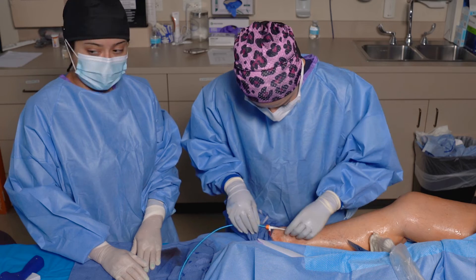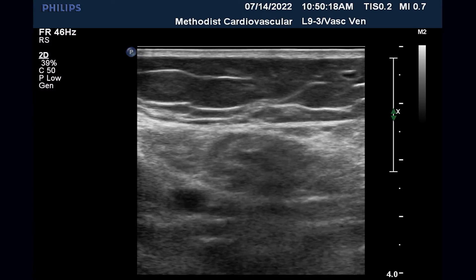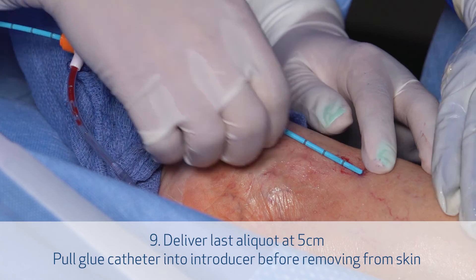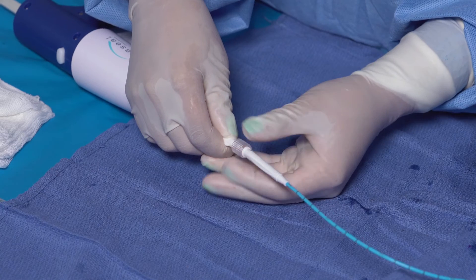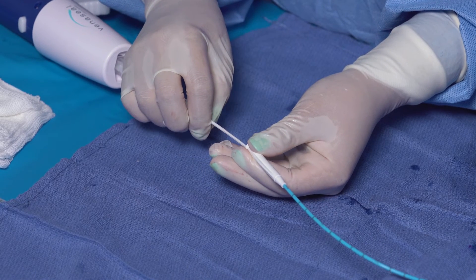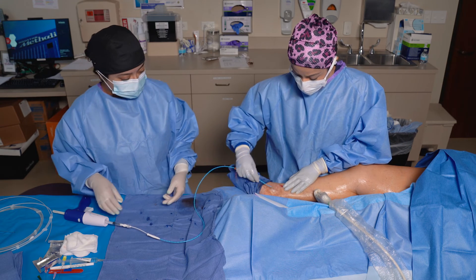At that point, remove the sheath and look at how much catheter remains in the skin. If it's 5 centimeters or more, you can deposit glue one more time. Here you can see we're already at 1 centimeter, so we're done. Unscrew the white glue catheter and pull it back into the blue catheter — you feel a bump as it goes past the laser mark, meaning you've safely retracted it. Then you can safely remove it out of the skin and hold pressure.